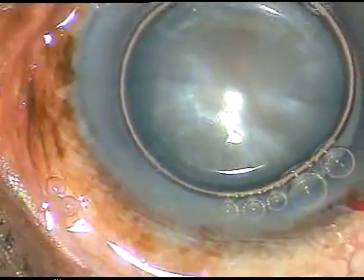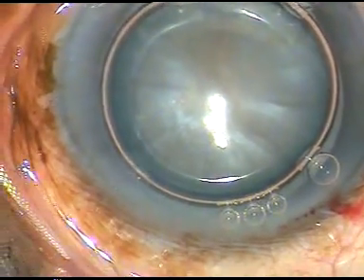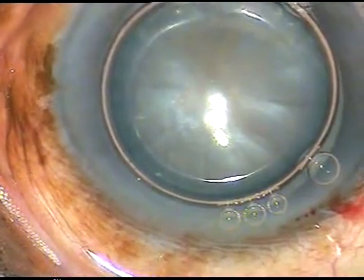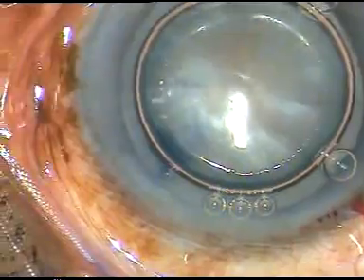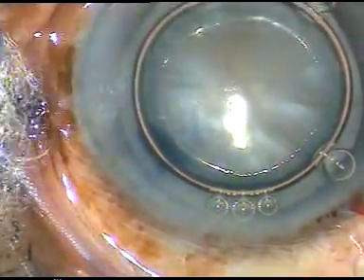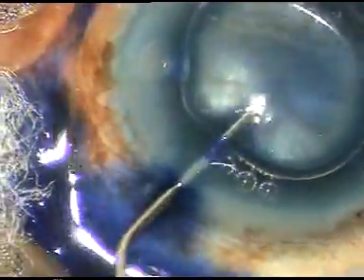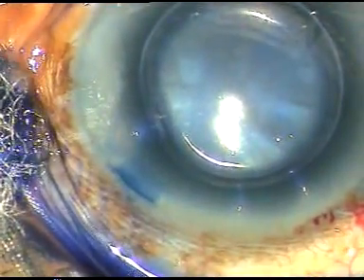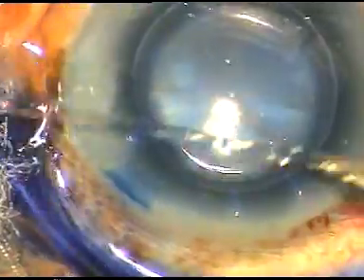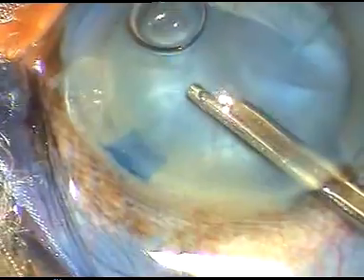Now I want to stain the anterior capsule with trypan blue dye. The dye is in a 2cc syringe with a 27 gauge cannula. The dye is sprayed evenly over the anterior capsule and care is taken to stain all parts of the capsule. Now the dye is washed out with a Simcoe cannula.